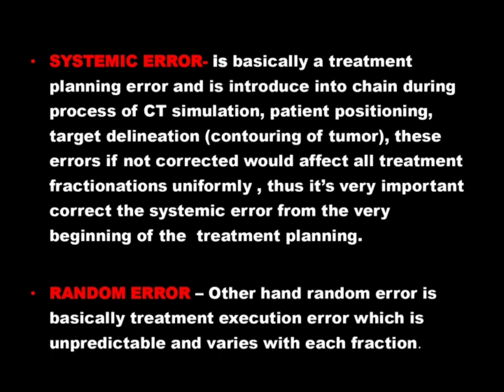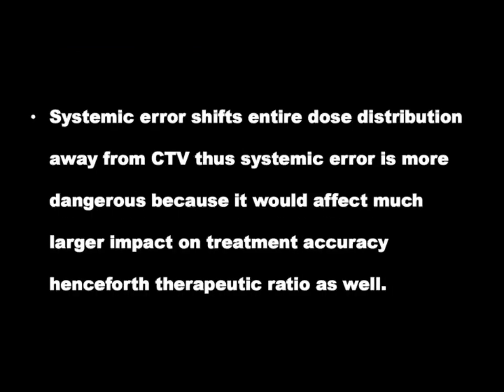And also the 3D data set which we acquired during the simulation is basically a single snapshot on that particular day and that particular time. But on the day of delivery of radiotherapy, this single snapshot is not going to help. Sometimes there is tumor movement, so online daily imaging is very much required for image guided radiotherapy.